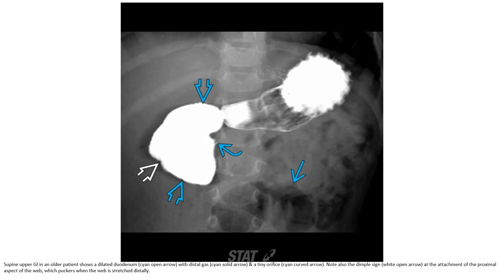Upper GI in an older patient shows a dilated duodenum with distal gas and a tiny orifice. Note also a diaphragm-like process at the attachment of the proximal aspect of the web, which stretches and distorts when the web is under tension.